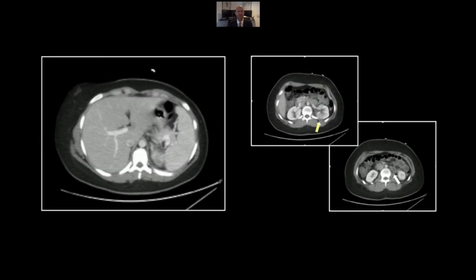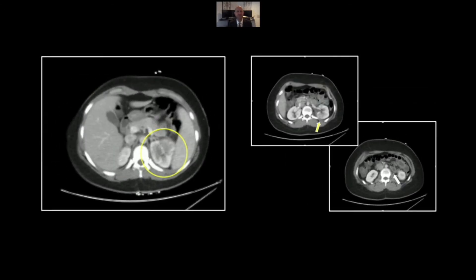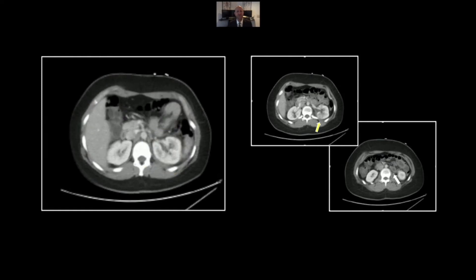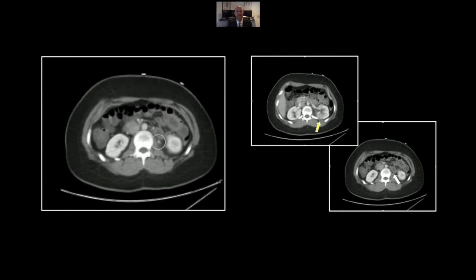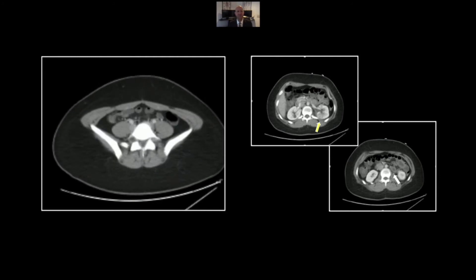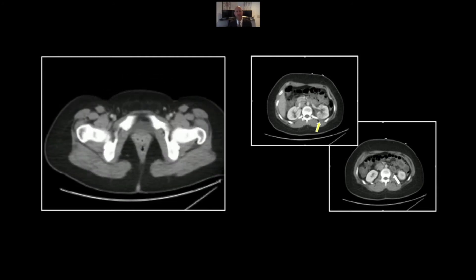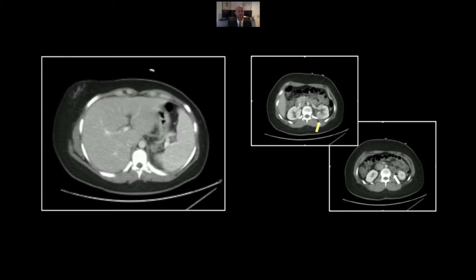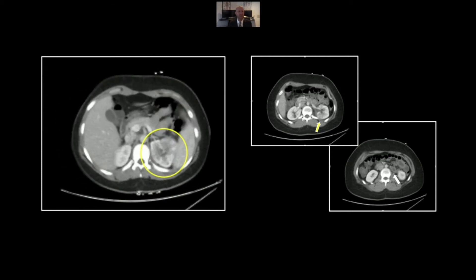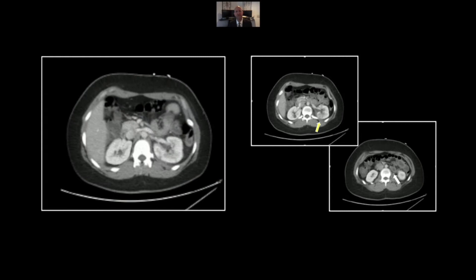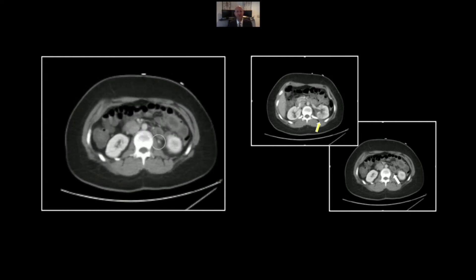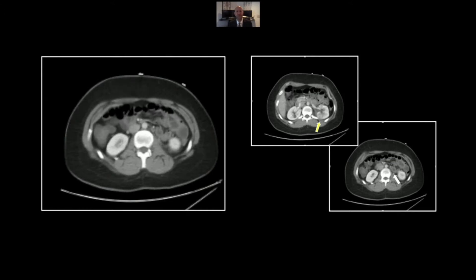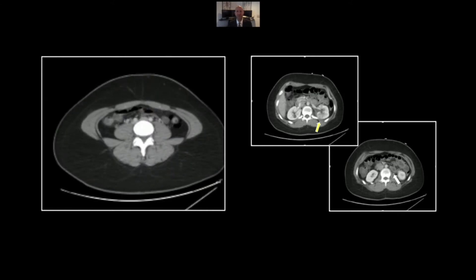Here you can see the hypodense cortex of the kidney in multiple locations, a little perinephric stranding as well, a dilated ureter, and that small obstructing stone. Remember, even small stones have a tendency to obstruct — in fact, disproportionately so compared to large stones. The theory is that the mobility of a smaller stone within the ureter actually causes more mural swelling, contributing to a greater likelihood of obstruction.